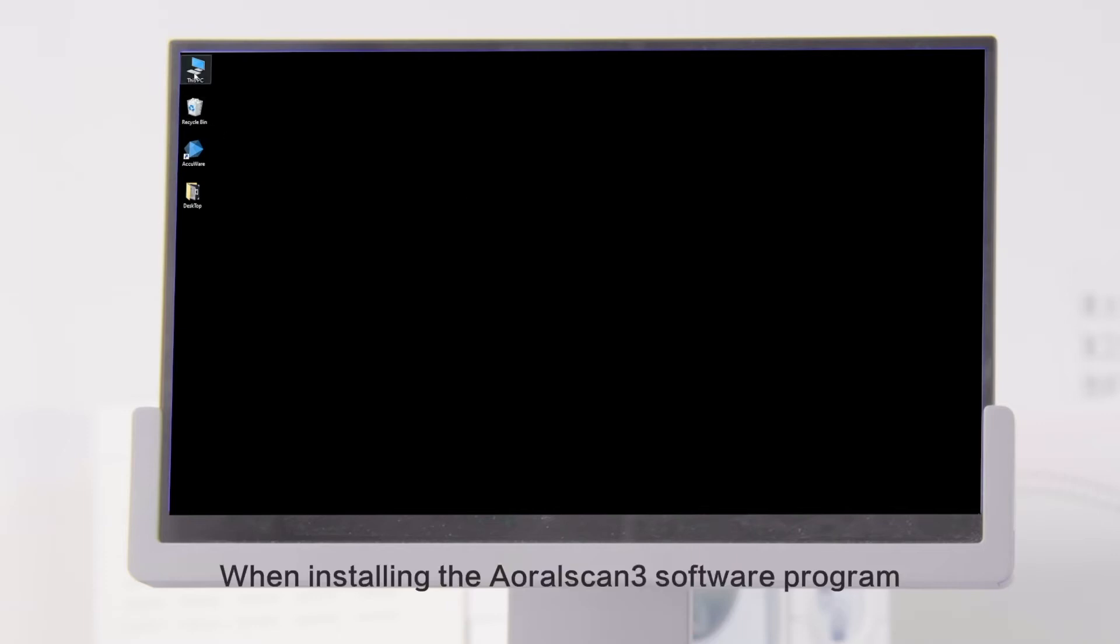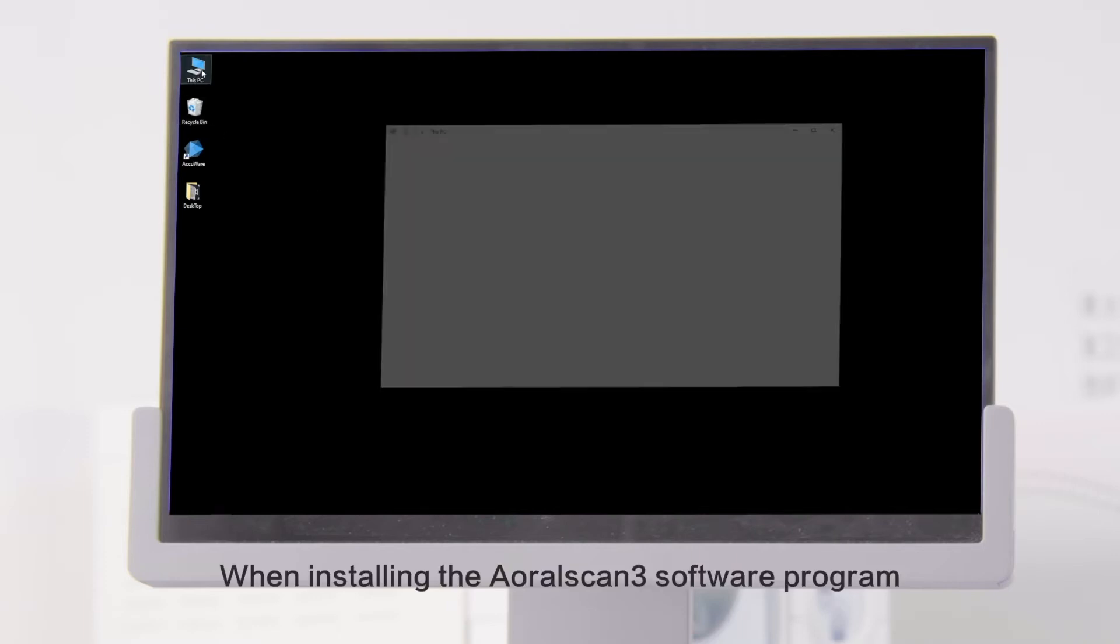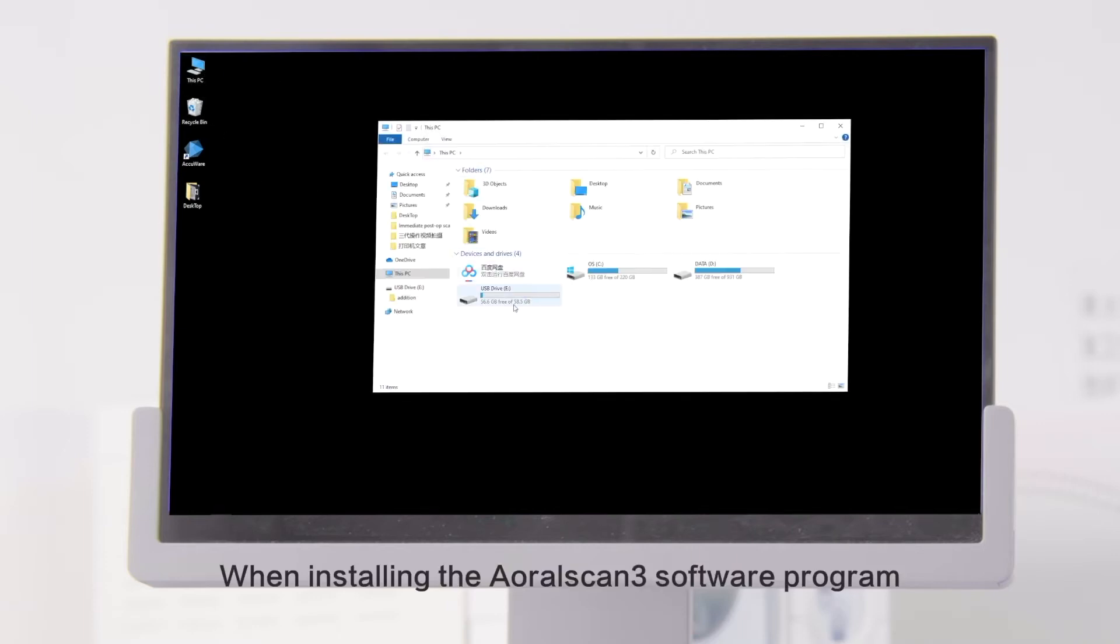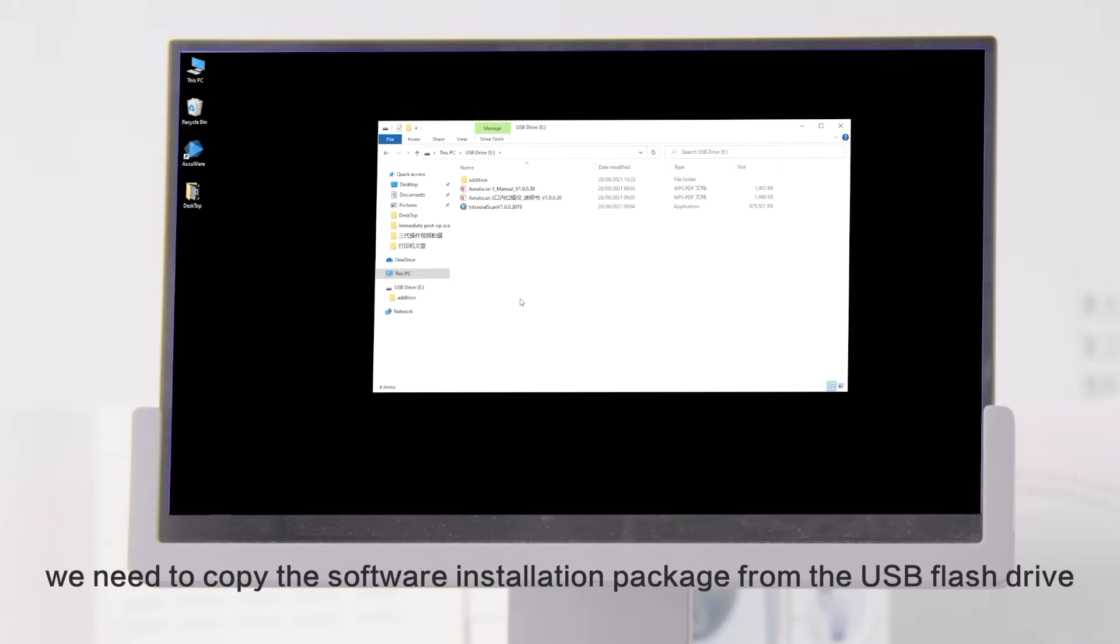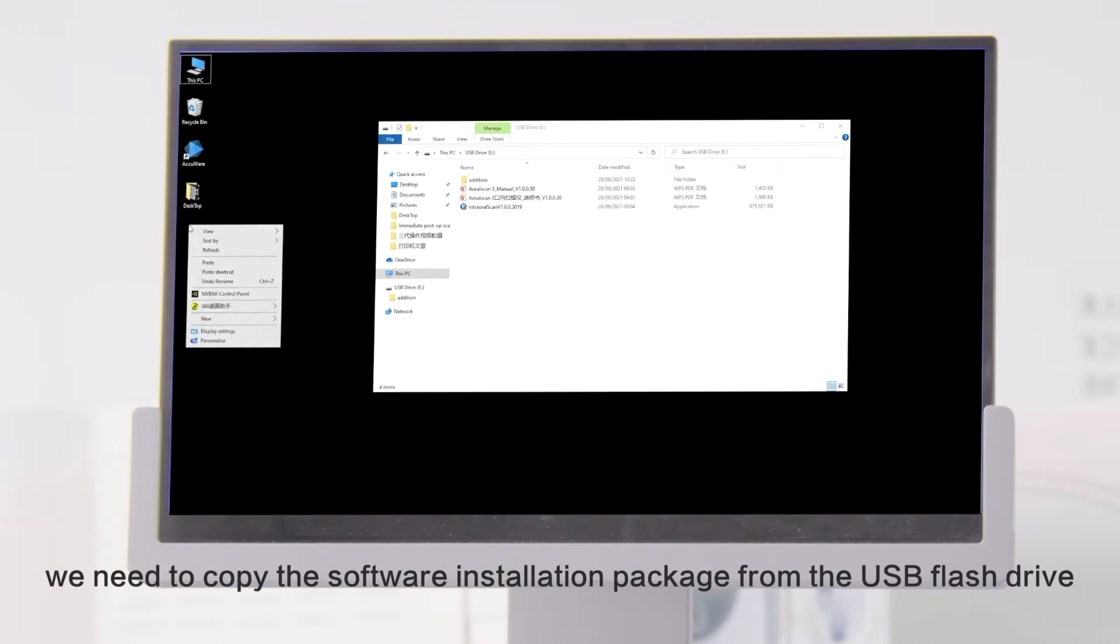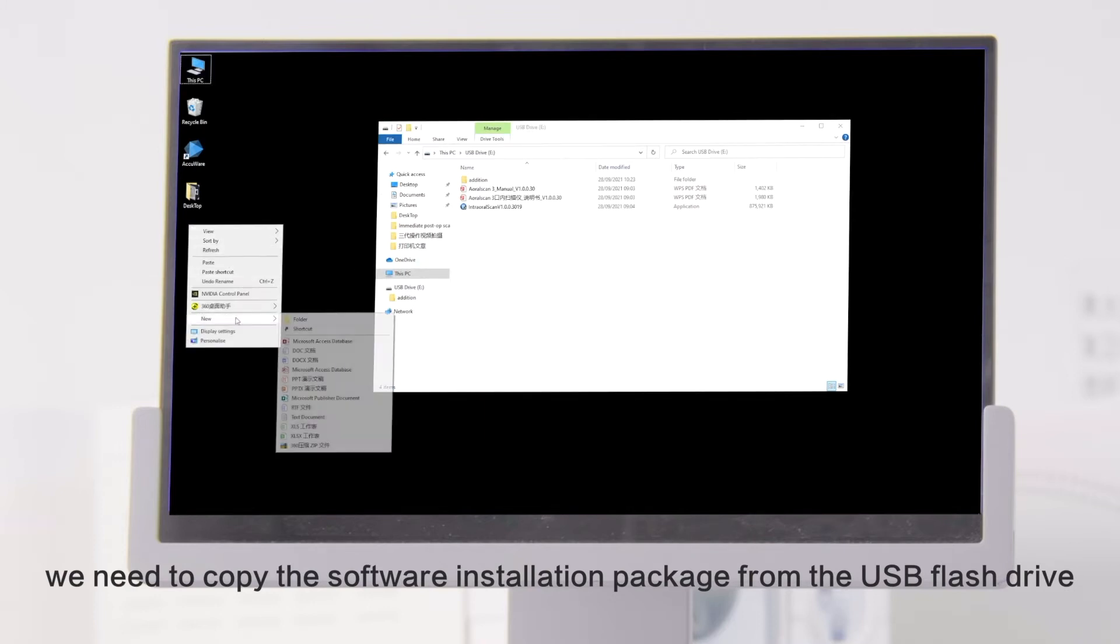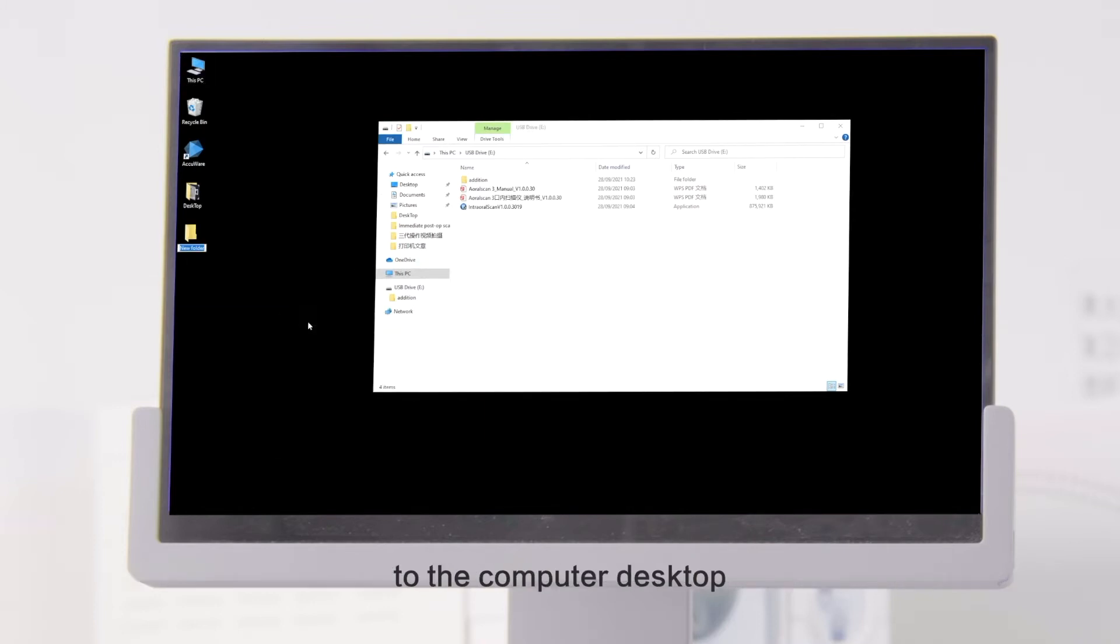When installing the Aoralscan3 software program, we need to copy the software installation package from the USB flash drive to the computer desktop.